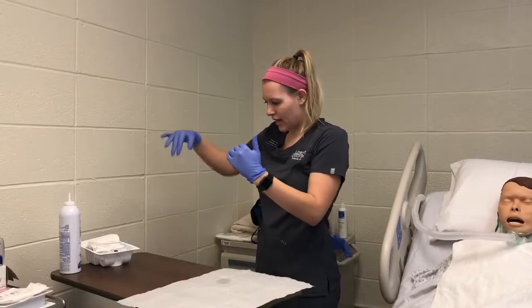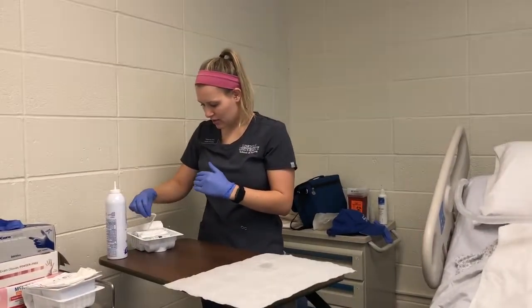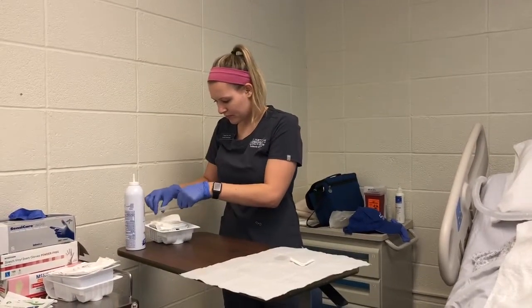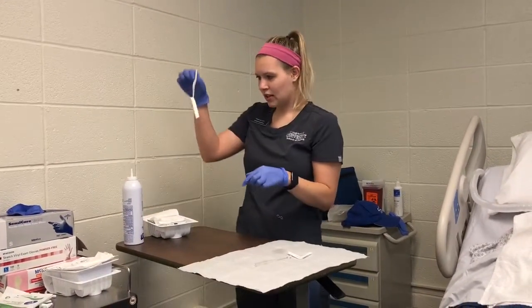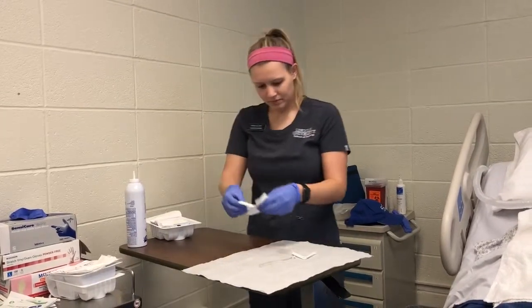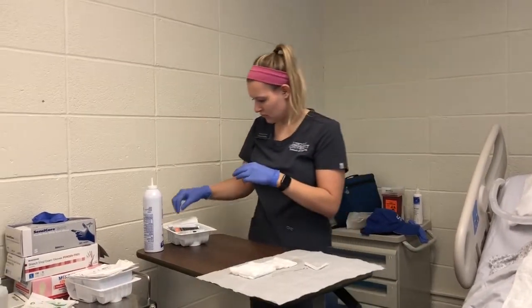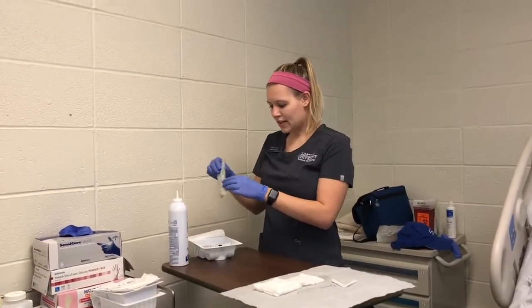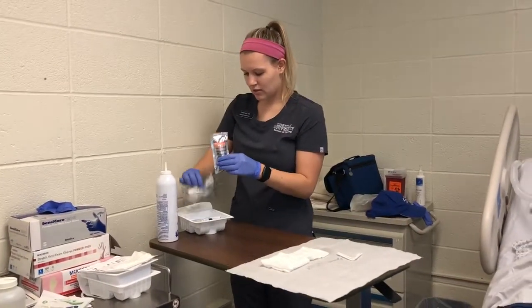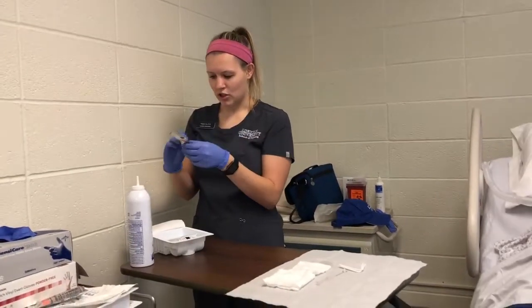And we can get rid of that. So now I have all this stuff in my sterile kit that I can move on to this sterile drape. There are some things in here that I won't need, like these trach ties. We're not going to use that kind. So as far as in the kit for cleaning purposes, we have 2 of these peroxide things. We're just going to need 1, so I'll get rid of 1 for this demonstration.